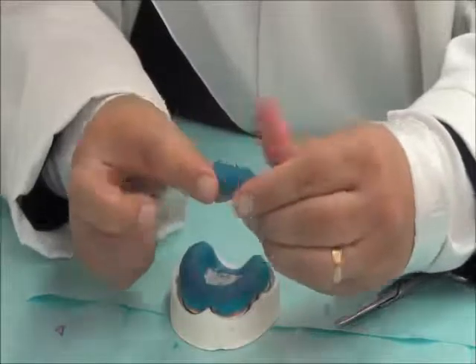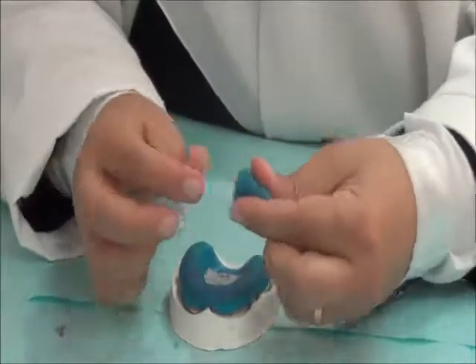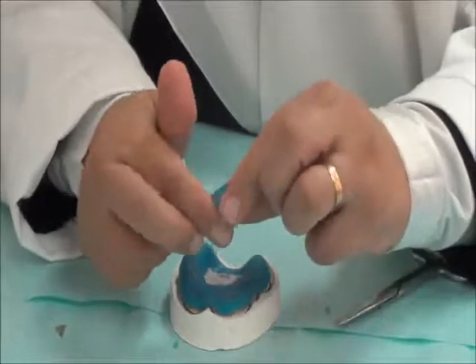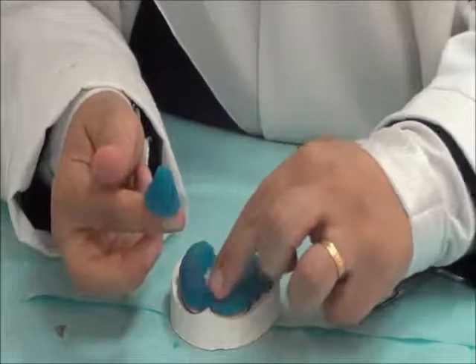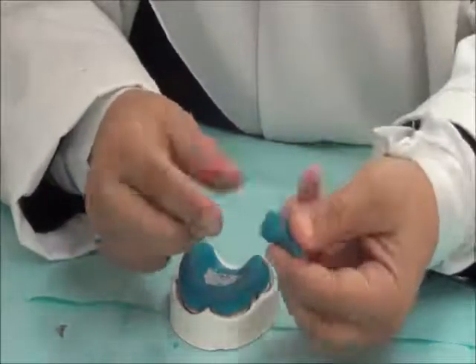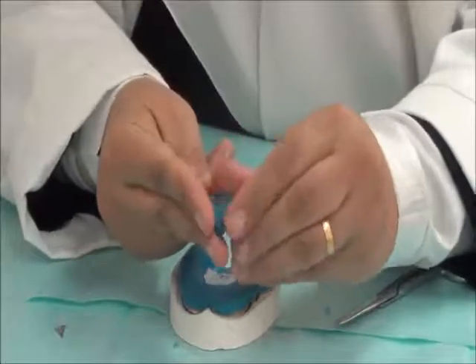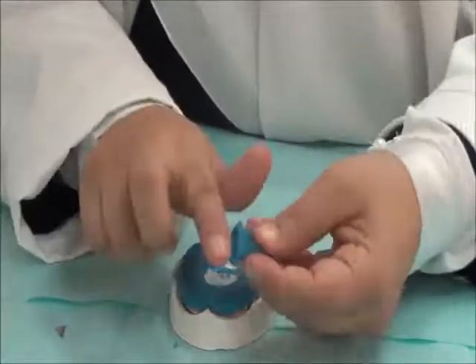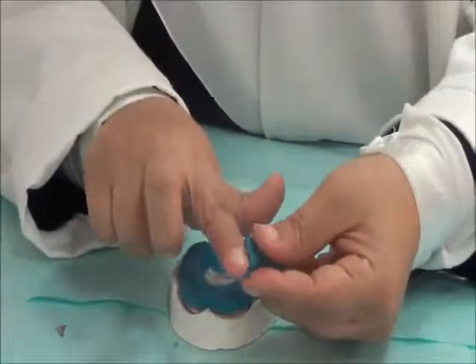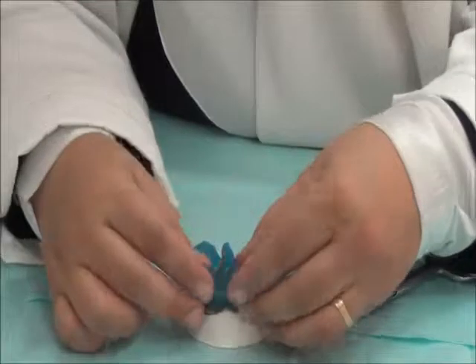We make the base a bit wider than the upper part. This will allow us to adapt the tray handle to the tray body well. So, first of all, we made it wider from the base than the tip of it, and we press it like this, so we can adapt this easily to the tray from beneath.